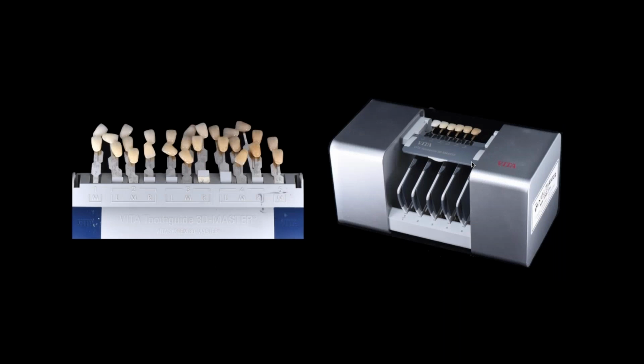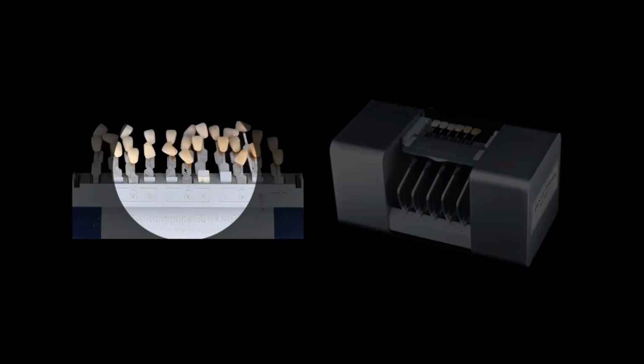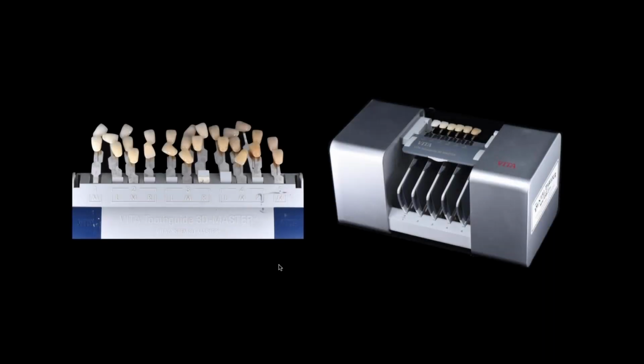You heard me mention the linear guide. This is kind of interesting because, funny enough, I'm not a fan of this 3D guide. I know a lot of people have these. I'm really a fan of the linear system. Why? Because the linear system actually is a little bit more systematic for me. It's much easier to teach and it's much easier to understand.